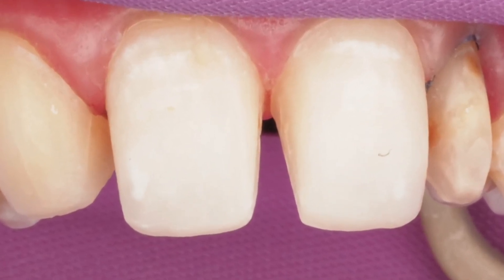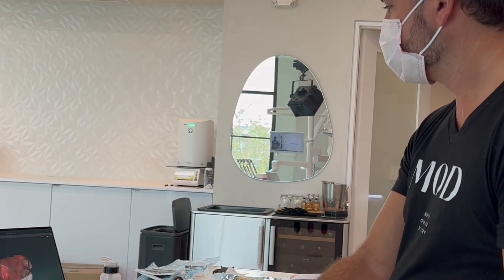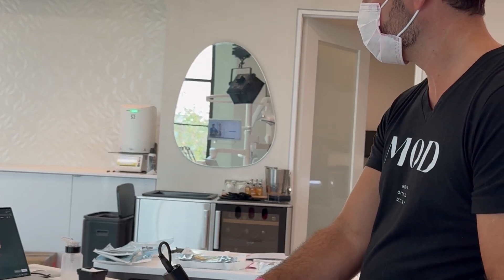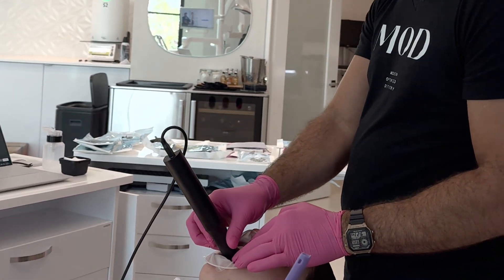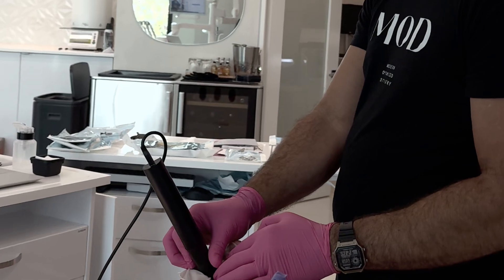Make it look a little bit more like a permanent tooth. So this is kind of what we're at here — we're always compromising between reduction, keeping enamel, and tooth movement. Doing a little intraoral scan here with an experimental scanner, one of 10 different scanners that I'm testing right now.